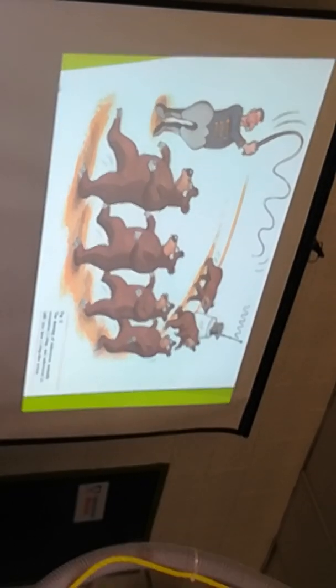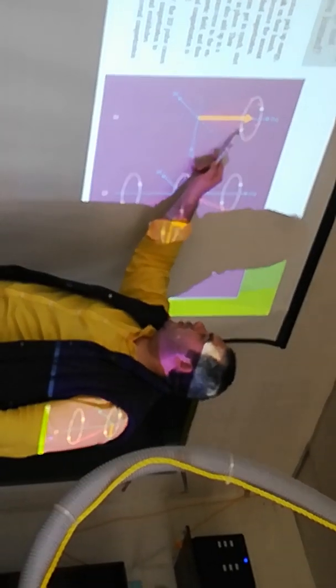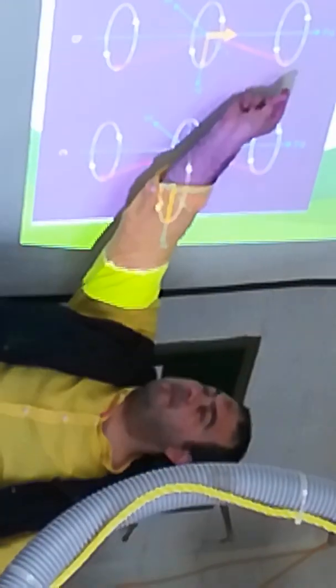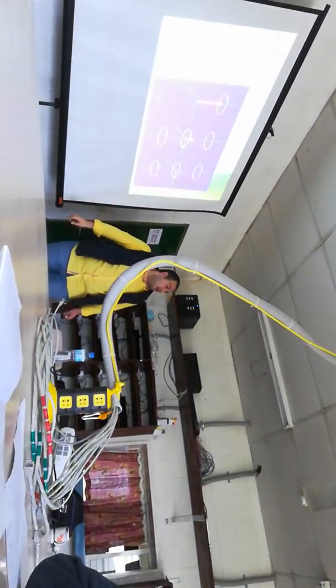Okay, so the protons will be in phase, not out of phase. Here, the protons are dephased, there is a big distance between all of them, okay? But here, all of them are summed together, okay? That means in phase. And this causes another magnetization to appear, which is called transversal magnetization.